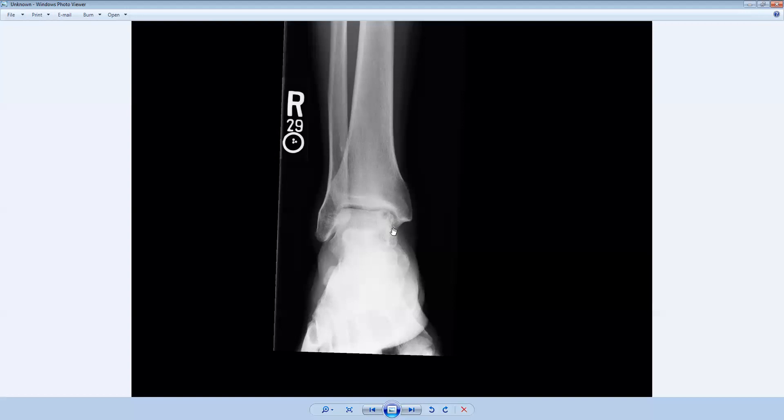The talus, which is this bone right here, is a very common site for an osteochondral injury. It's not the most common site. In fact, the most common site in the body would be the knee, the lateral aspect of the medial femoral condyle. But the talus is a very common site, and the capitellum in the elbow is another common site for an osteochondral injury.